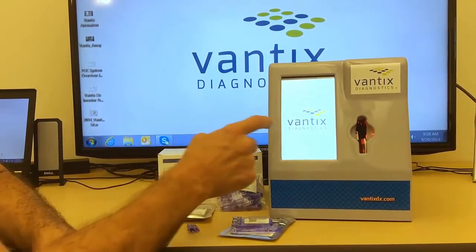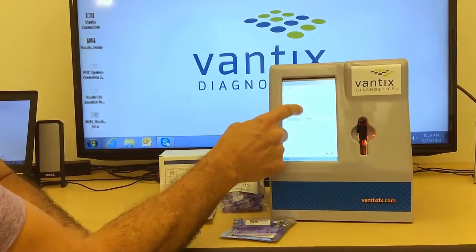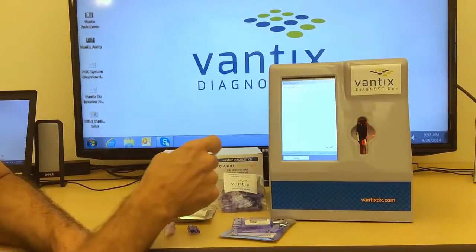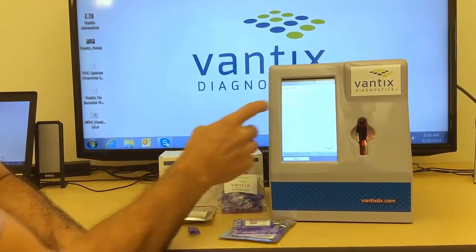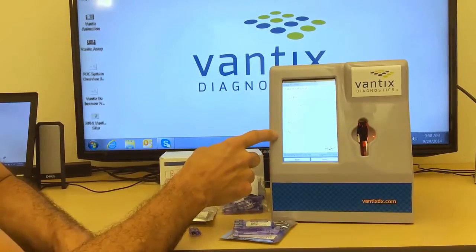On the Vantix reader we first start by having the user login with their username and password. We then select the task that we are going to run — in this case we are going to run a TSH and a free T4. The patient has already been pre-populated.